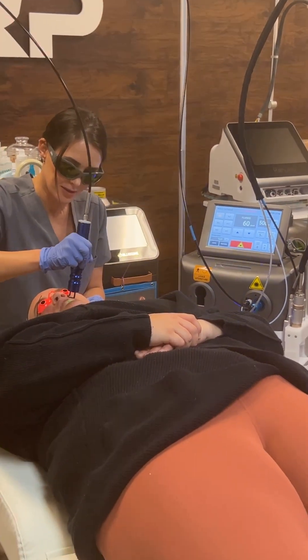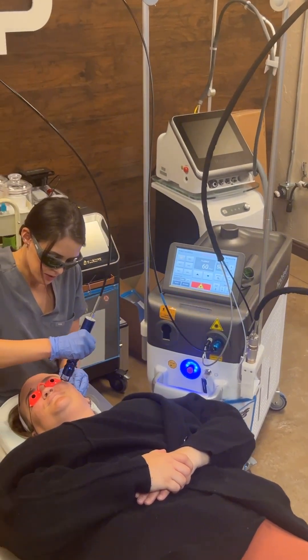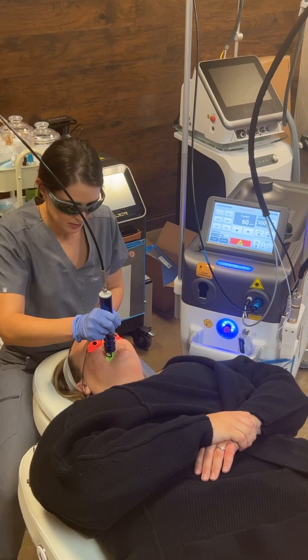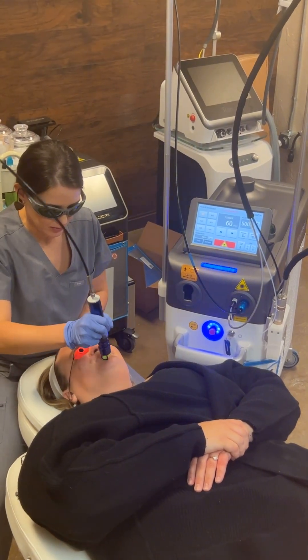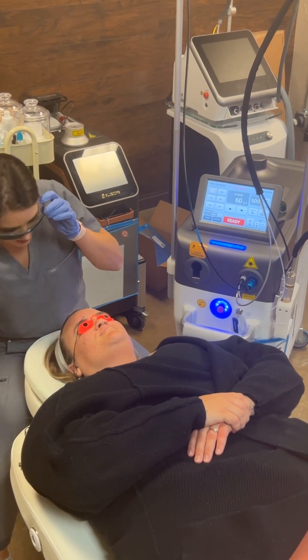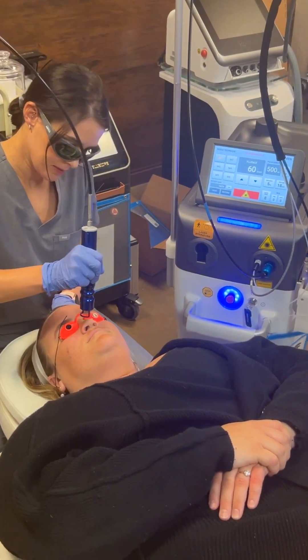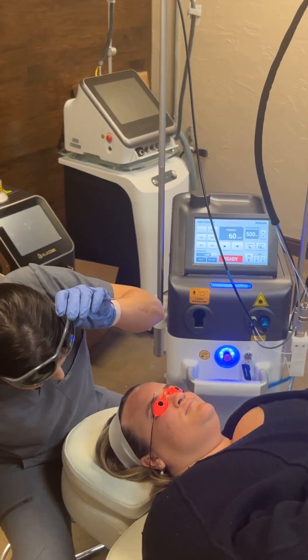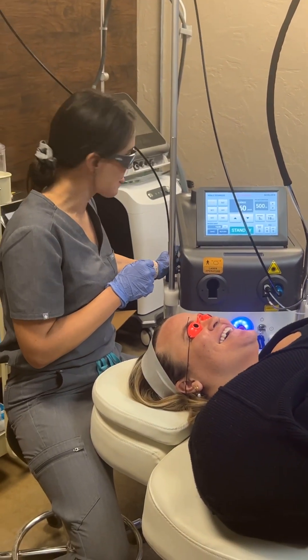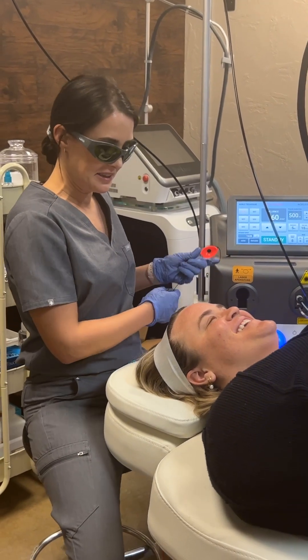Better than expected? Much better. I'm going to do it right here. I'm going to take the goggles off — it's going to be a bright light. And we're done.